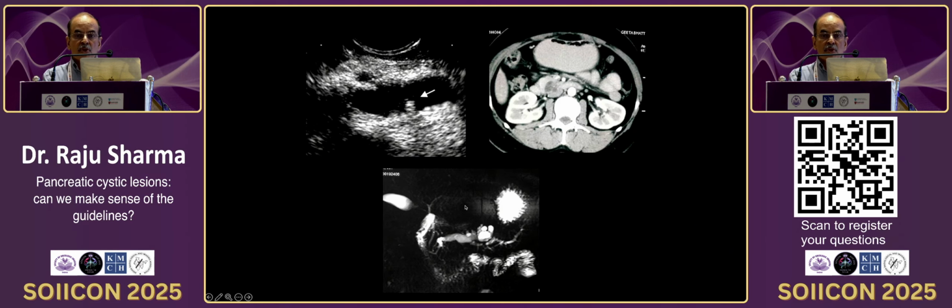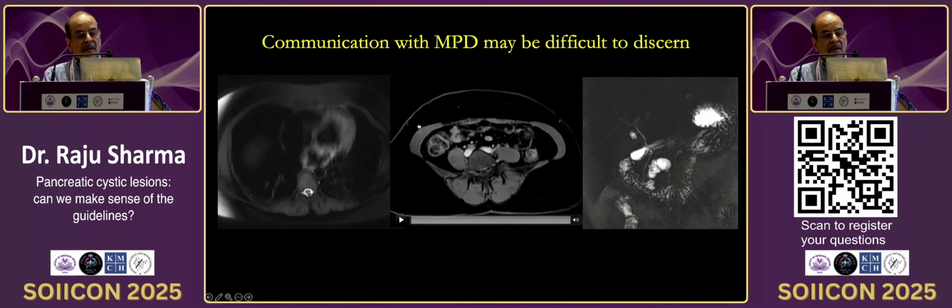These patients, when they show ominous signs or worrisome features, are frequently subjected to endoscopic ultrasound, and that's an EUS appearance where you can see this nodule. They can even inject ultrasound contrast during EUS, and if you can show enhancement of this nodule, this would then become a high-risk feature and the patient would require surgery.